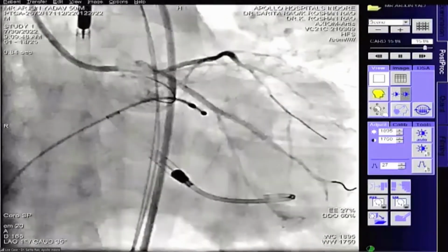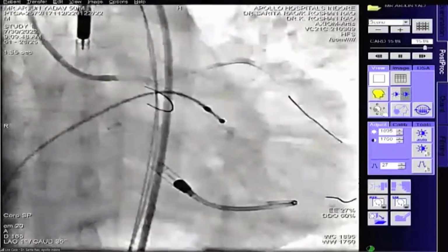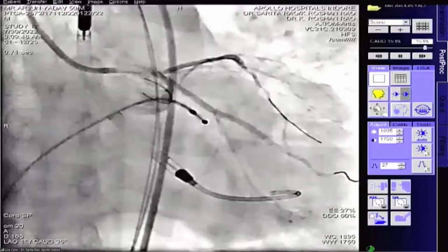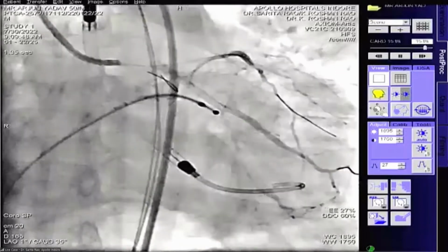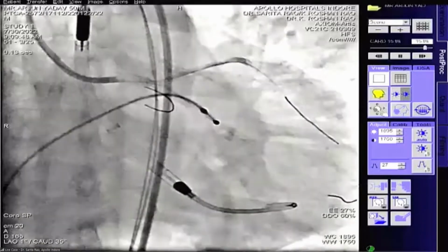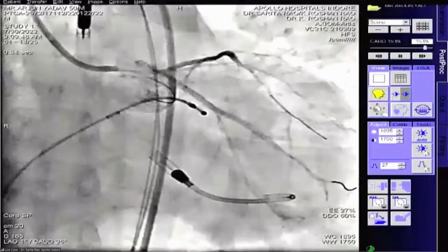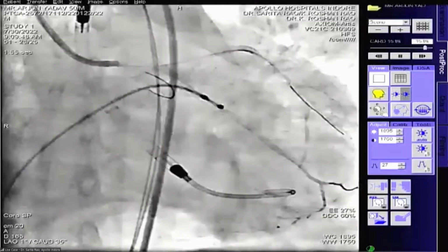Anyone else? 3.0 getting over-inflated to 4.0, would it be okay? Sorry, wasn't the vessel size 4.0? No, the left main is much roomier. At the LAD ostium, it was 3.2. Yes, the vessel size was 3.2 at the LAD ostium.